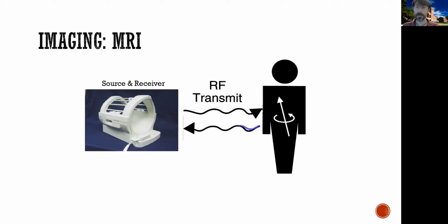In this other case, the energy reflected from the protons is weakened. It turns out that one of the things that makes the difference between a strong and a weak signal is whether you're using a certain part of the brain, is neural activity. So this already gives you a preview of how MRI works to study the human brain.